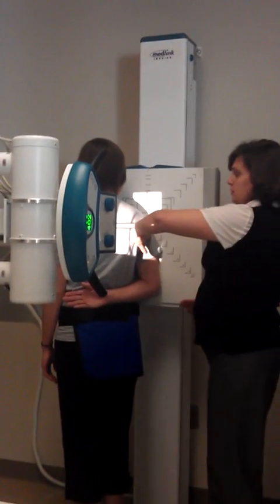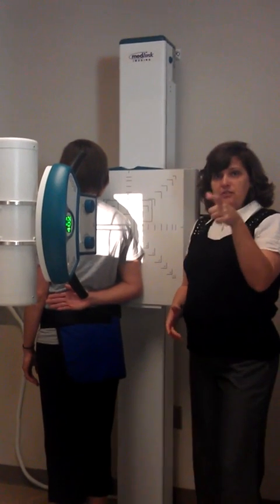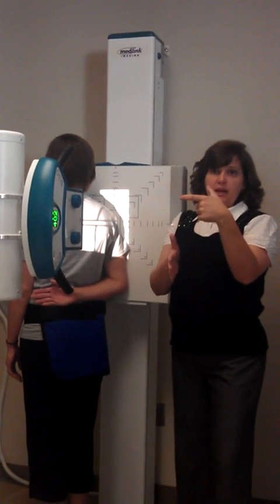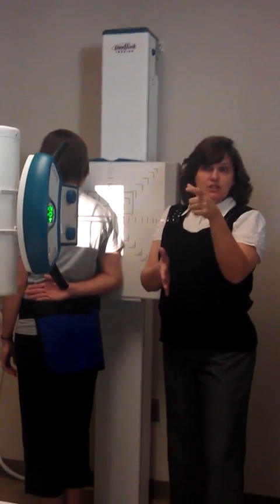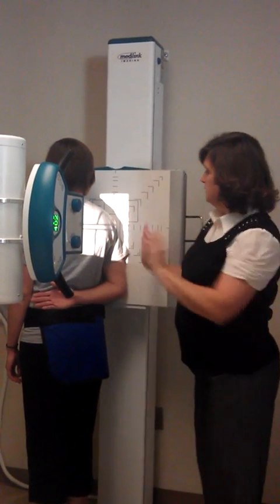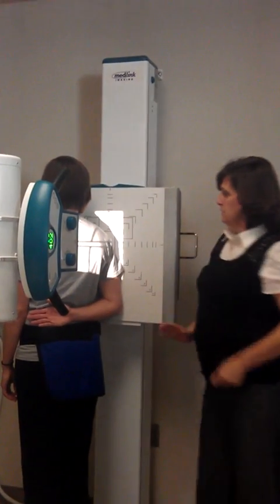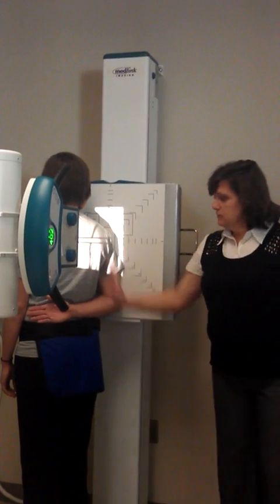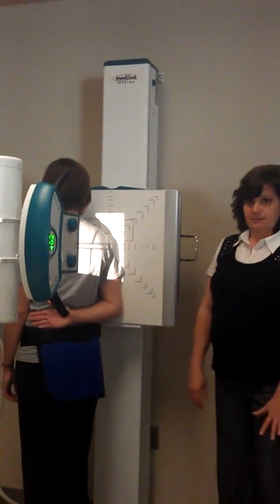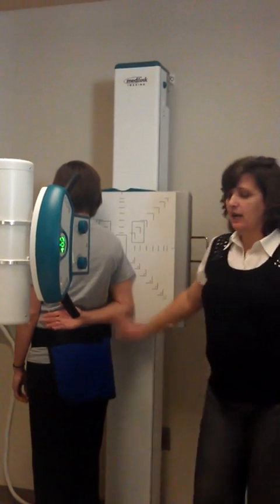So we're looking forward, making sure it's straight. I always do my fingers so I can feel my fingers on each border — if they're this way, they're not lateral. So I just rotate my hand until they're even. Some people do this to make sure it's flat. You can relax, ma'am. So this is flat.